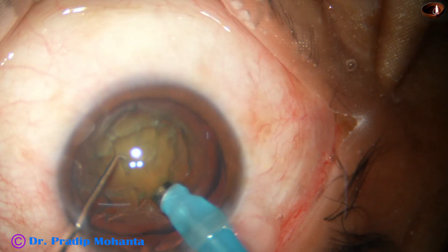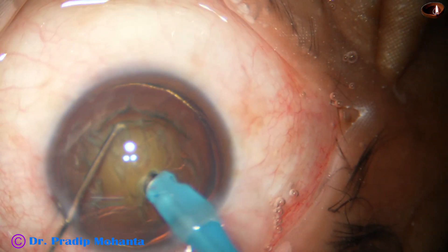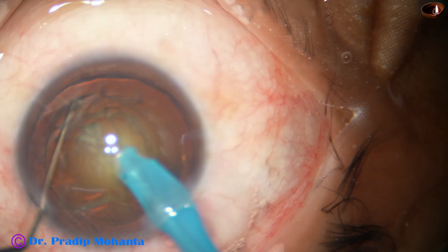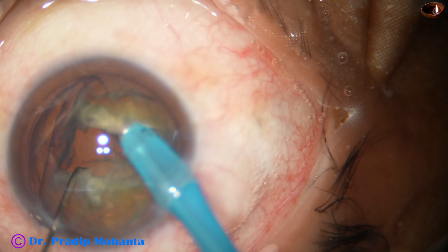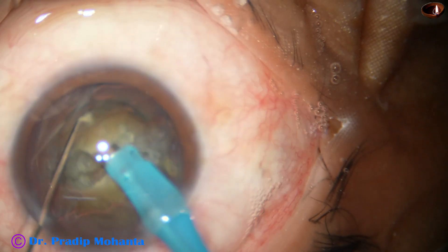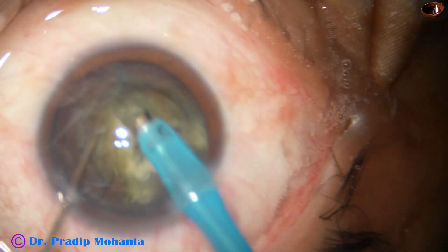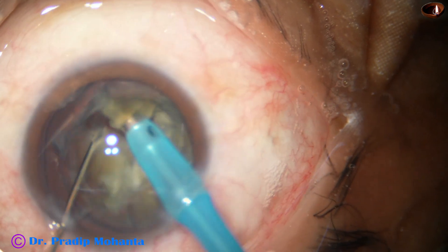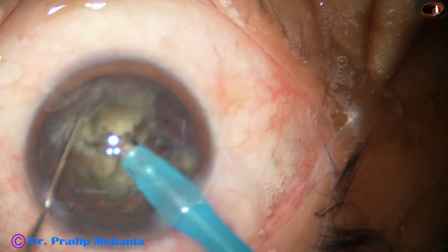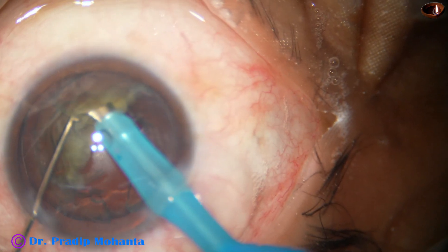My aim is to go till the end of the hard part. If there is an air bubble, we have to remove it first to have good visibility. Now the handpiece goes through the substance of the nucleus and the nucleus is chopped into two hemi-nuclei. Each hemi-nucleus is then subdivided into two large fragments. I come to the other hemi-nucleus and divide it also into two large fragments. Now each fragment is held with vacuum, brought to the center of the anterior chamber, and emulsified.